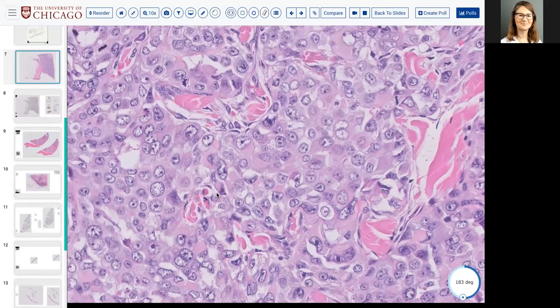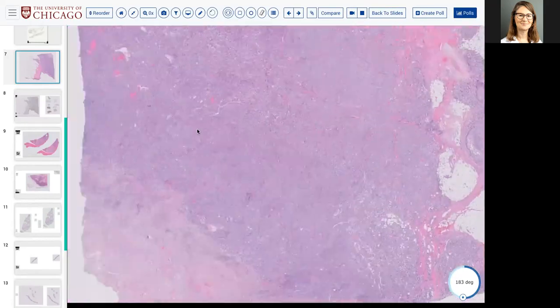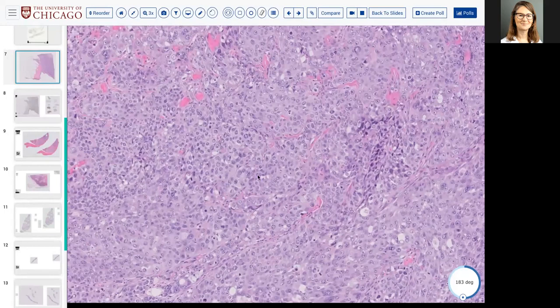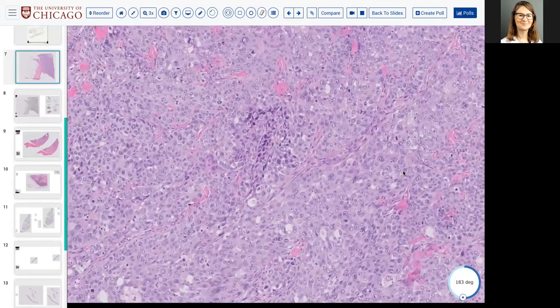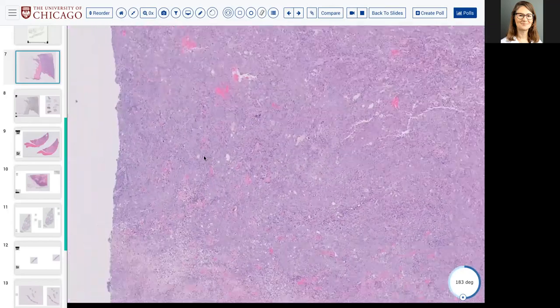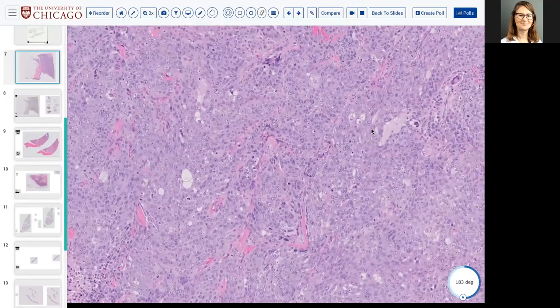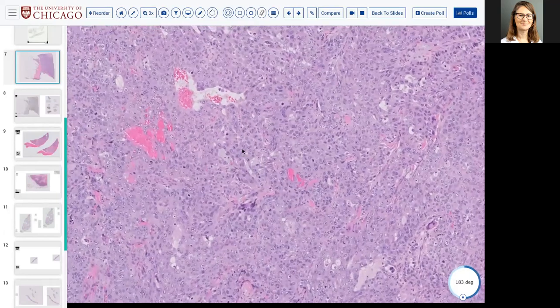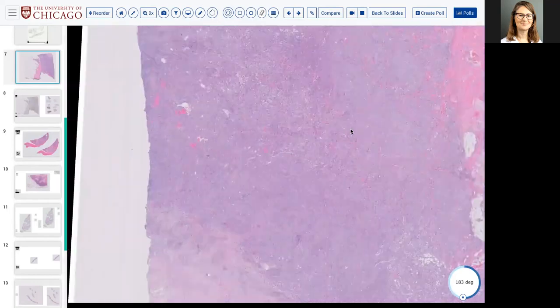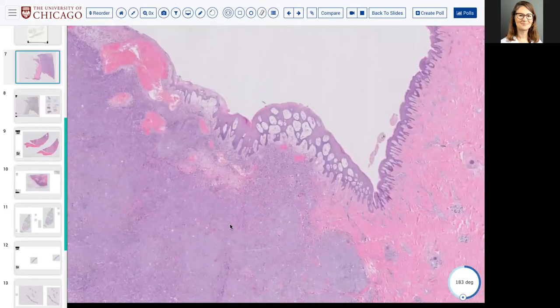There. All right, so you have something epithelioid, sheet-like, that appears quite malignant with lots of mitoses, and here's your necrosis, with an occasional rhabdoid appearance, not necessarily overtly vasoformative, but certainly you'd want to consider a solid epithelioid angiosarcoma. But I'll just tell you that the vascular markers are negative in this case. So with a malignant epithelioid and rhabdoid type of tumor, in this case in the chest wall, what do you want to do?